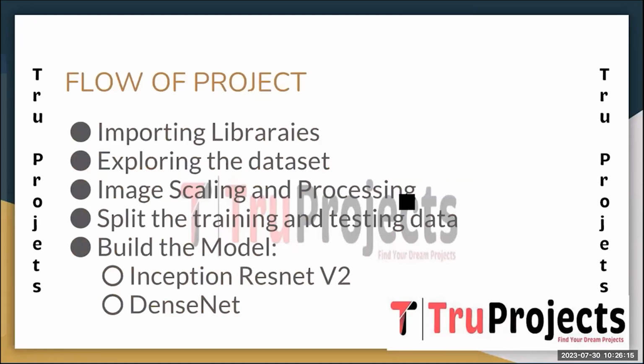The third one is image scaling and processing. Before feeding the images into the deep learning model, we process them to ensure a consistent and optimal input format. This step involves scaling the images to a standard size and applying any necessary image processing techniques like normalization and data augmentation to improve model generalization.